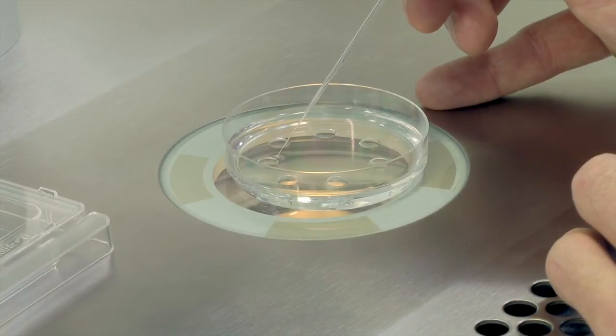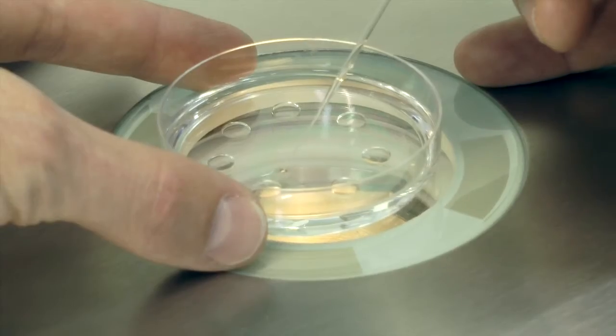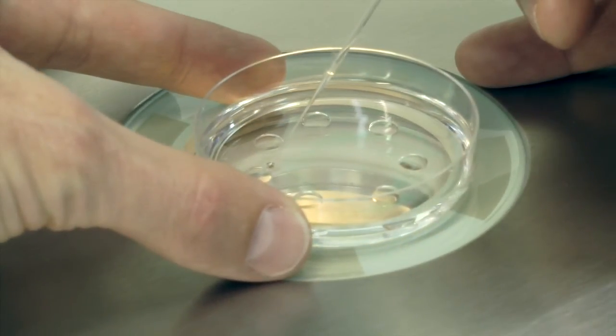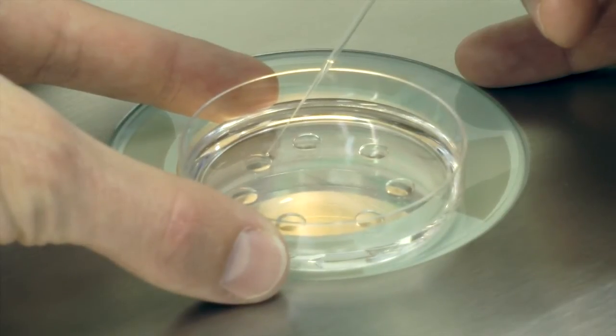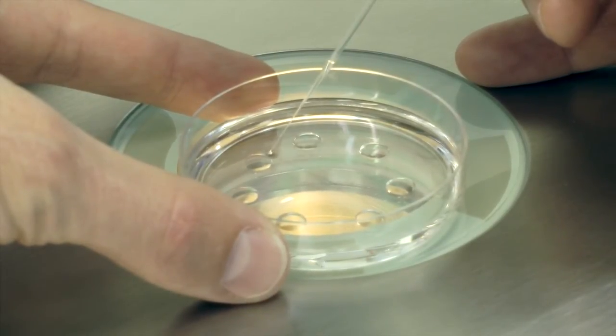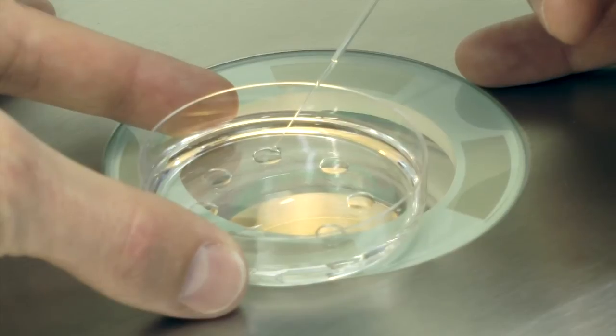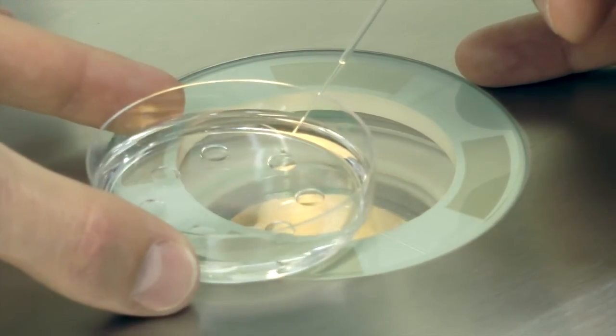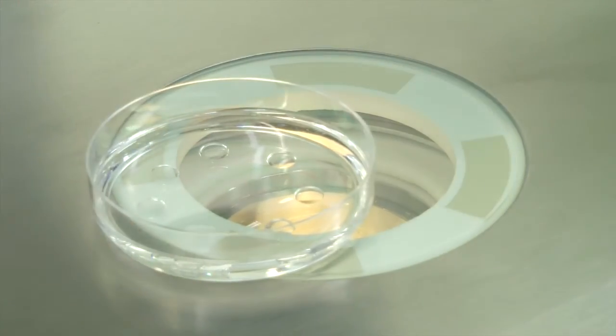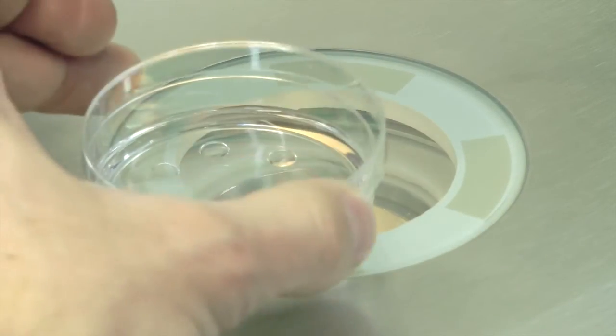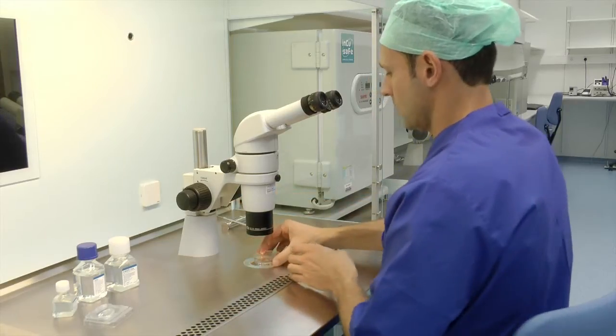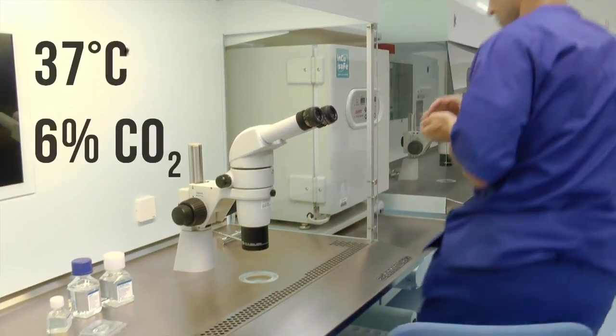If you are assessing the ICSI oocytes, then you can use the G1 Plus dish, the micro droplet dish that you have prepared the day before. Wash the zygotes extensively in the G1 Plus micro droplets that you have prepared the day before, and then place them into new G1 Plus droplets. Culture them at 6% CO2 and 37 degrees Celsius.